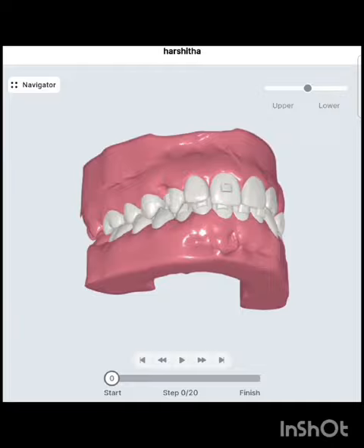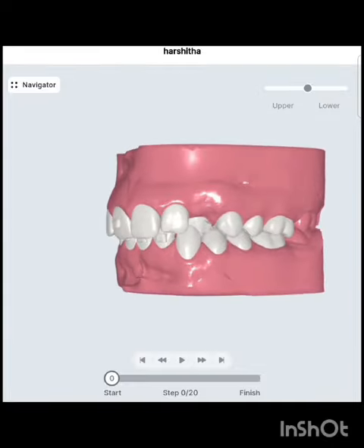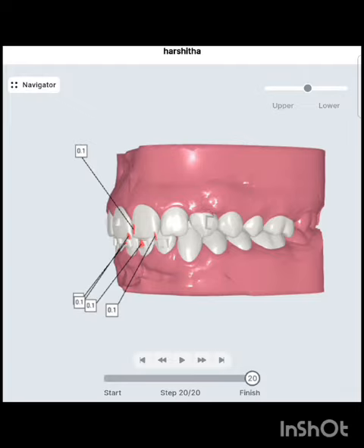This is the aligner plan with attachments, and there are 20 trays in total. The treatment was planned using an application called Archform by Dentsply Sirona aligners.